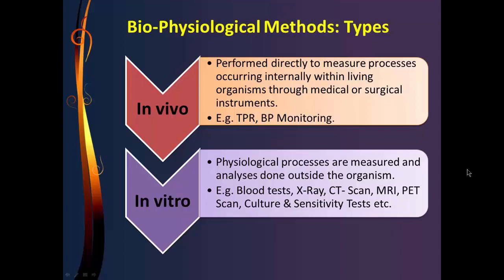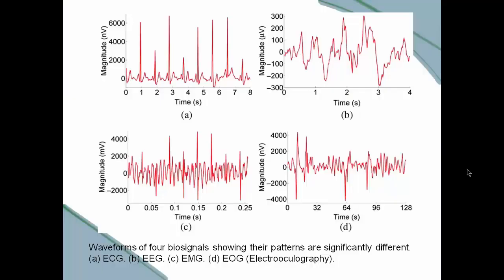When we look at different types of measures, I've got 4 up here that we can look at. First of all, A is the ECG, the electrocardiogram, right here. And that looks very regular. It's very periodic. But then again, notice it's periodic, but it's not exact. So it's far more periodic than it is aperiodic.